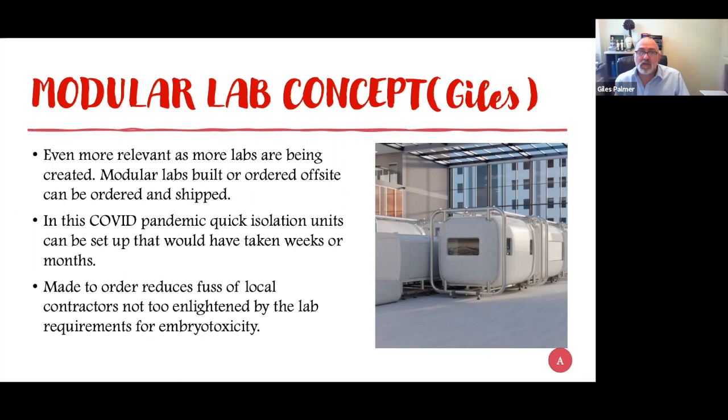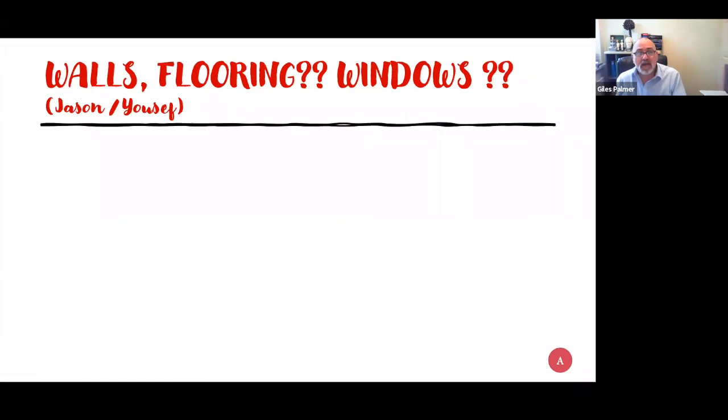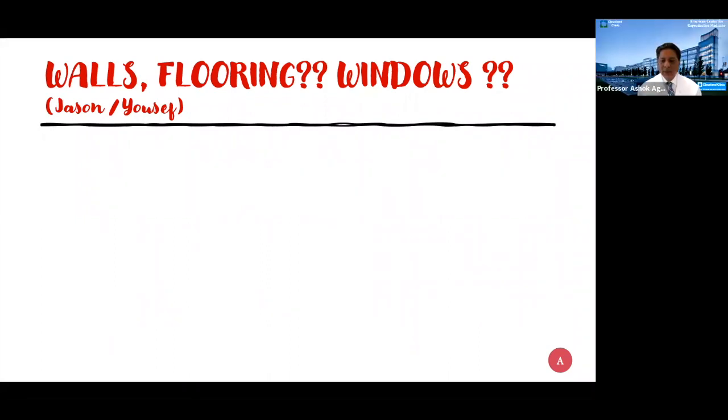These could be units where you could add on very quickly and effectively to produce your clean room, and that's what they are. They are clean room modular units to be a lab or any kind of adjacent room into your lab. So these are highly transportable, and they do offer, as we say, the clean room concepts, which you'll hear again in the following questions about what an IVF unit has to have. Okay, well, thank you very much, Dr. Giles.